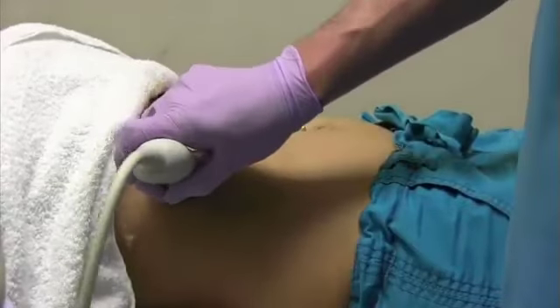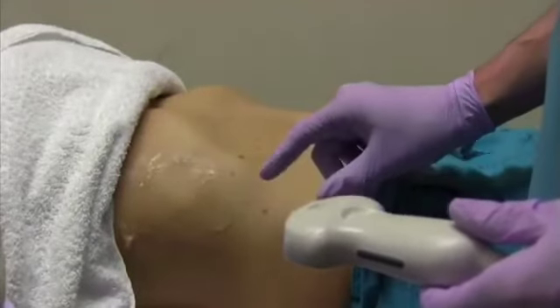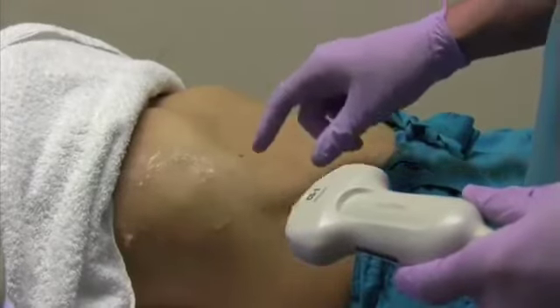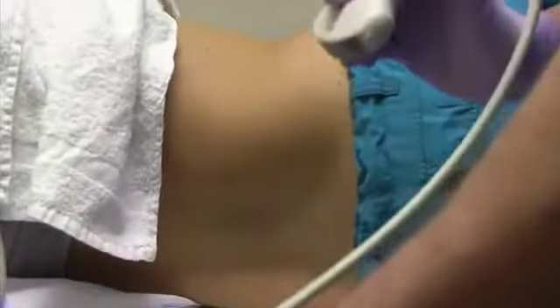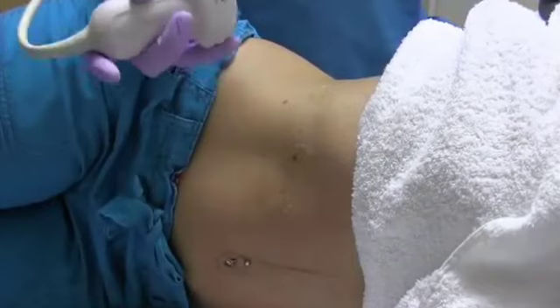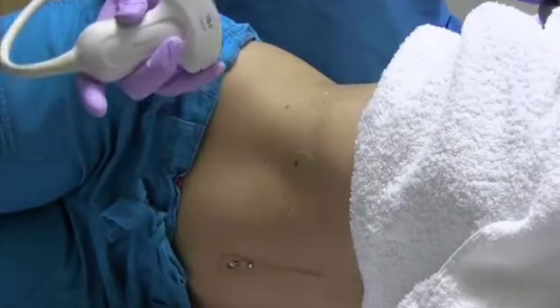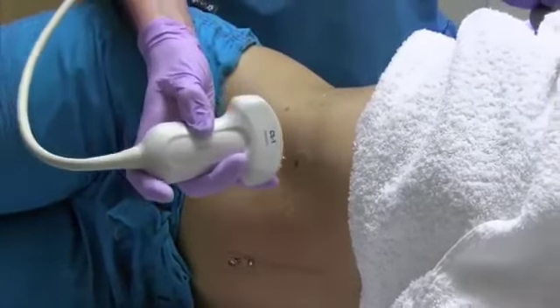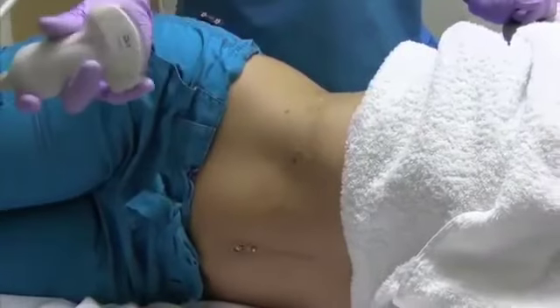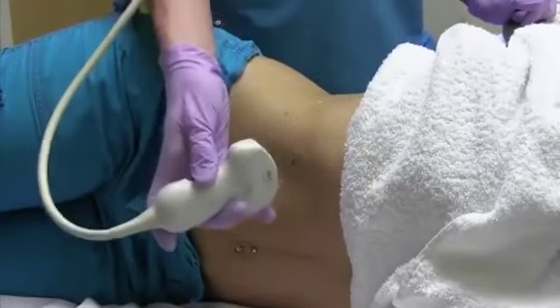For the gallbladder, we also get decubitus pictures just to make sure there's no stones trapped in the fundus or the neck of the gallbladder. So for that, I'm going to have you turn onto your left side away from us. The gallbladder usually moves a little bit forward. After you get your supine pictures, you want to decubitus the patient to make sure there are no stones stuck in the neck of the gallbladder. You have the patient turn on their left side away from you, and that usually brings the gallbladder forward here.